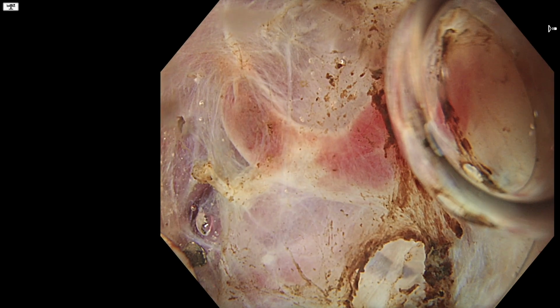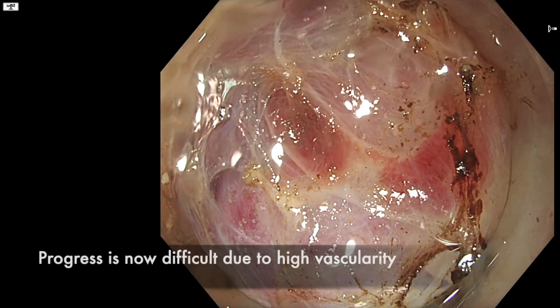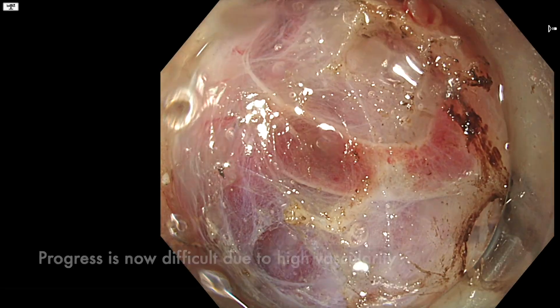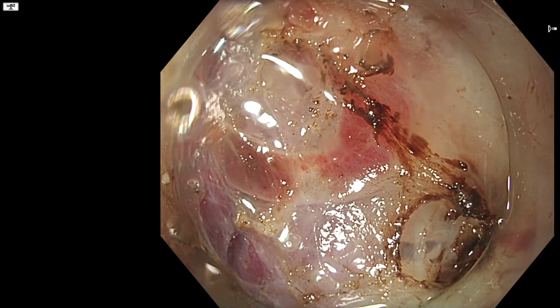Unfortunately, the submucosa was becoming increasingly vascular and deformed. I was really struggling here to understand what the direction of the plane was.